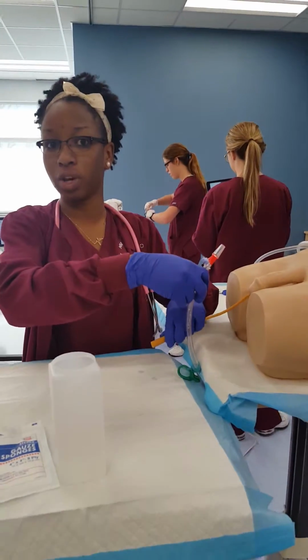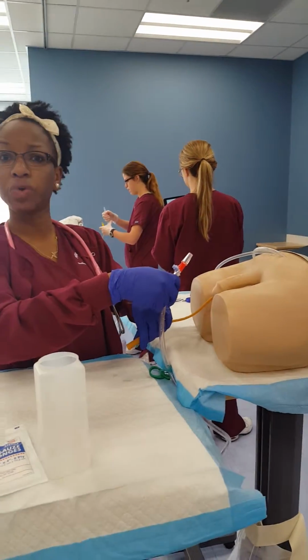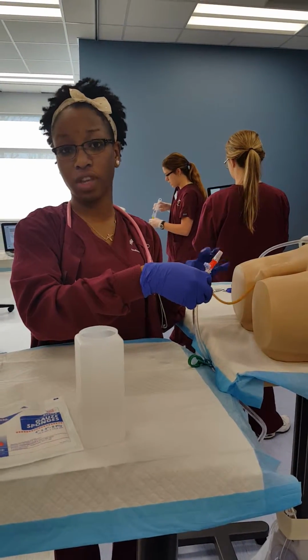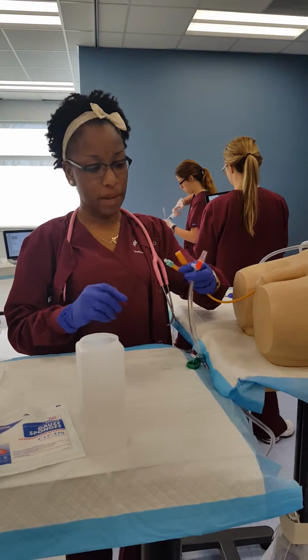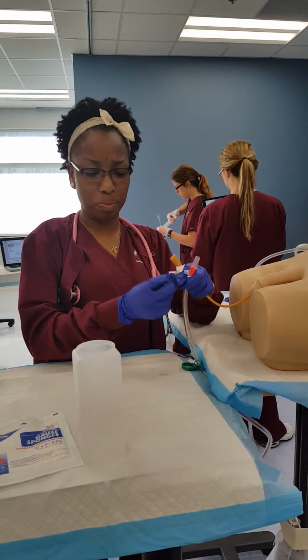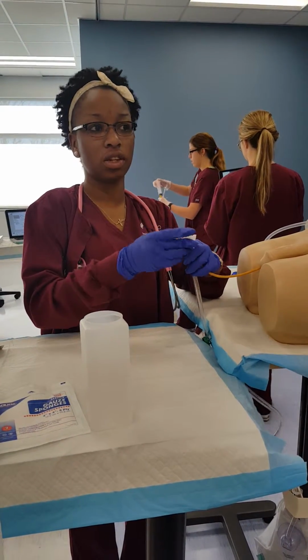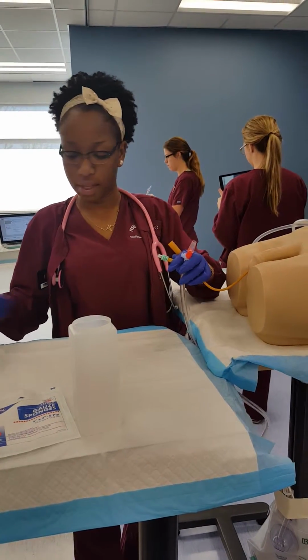I'm going to put this in a drain basin or urinary cup, so that he can urinate out everything, all the clots or whatever occluded it, or any stone. So that has happened. Everything is fine. Just for safety reasons, not because this touched anything, but just to be safe, it's better safe than sorry, I'm going to clean the end to continue that sterility while I put this back in there.